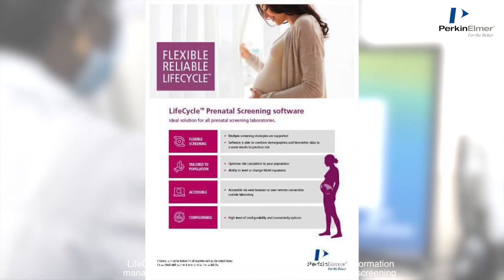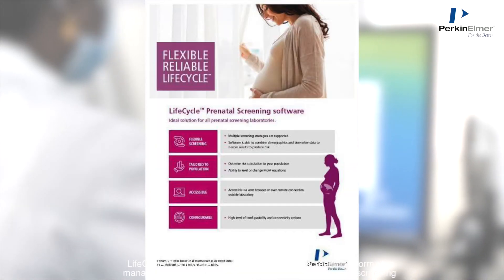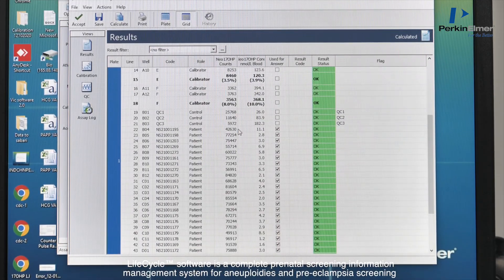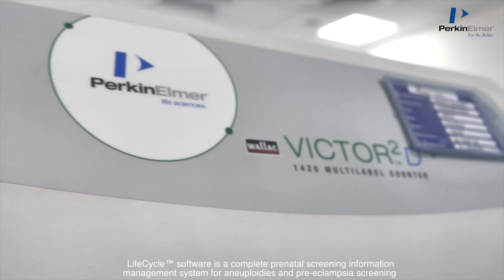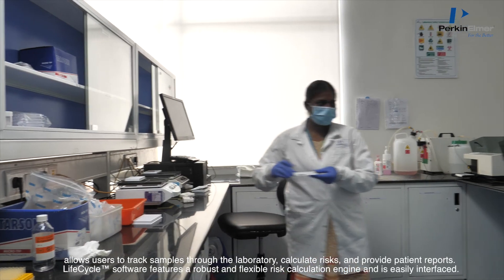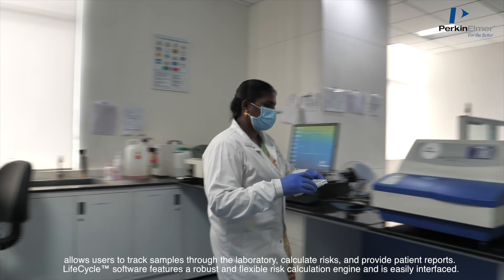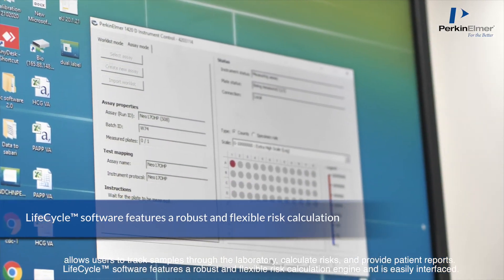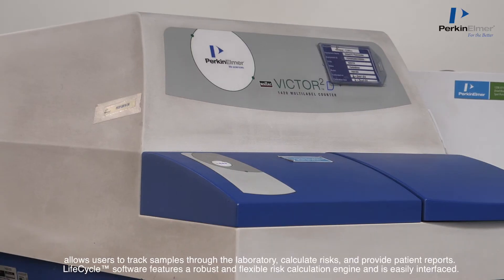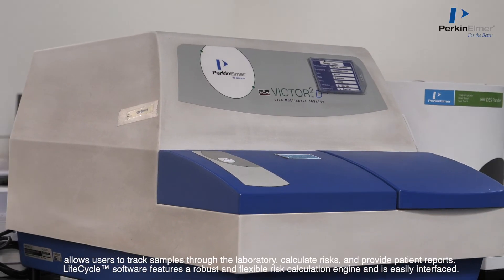Lifecycle Software is a complete prenatal screening information management system for aneuploidy and preeclampsia screening. It allows users to track samples through the laboratory, calculate risks, and provide patient reports, featuring a robust and flexible risk calculation engine that is easily interfaced.